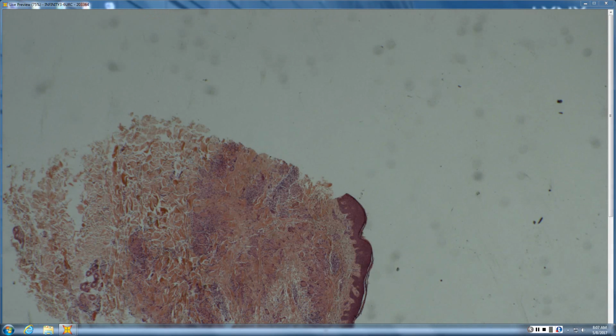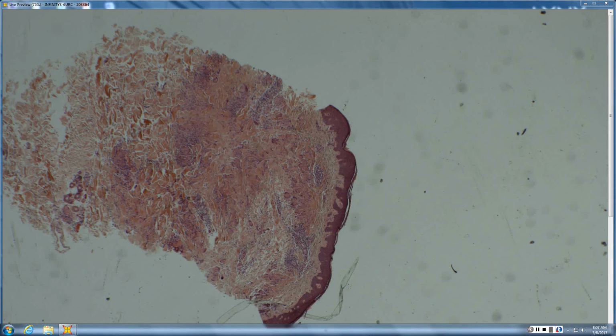So it looks like GA. Okay, so you get the easy button for that, and why GA? So you have kind of central necrobiosis with a palisade of histiocytes. Scan, you can see all the multinucleated histiocytes. Yep. So they're multinucleated cells as a clue that they're histiocytes. And so you have epithelioid cells and multinucleated histiocytes. They're in the dermis, sometimes in a palisaded fashion, and they are certainly patchy and focal, not top to bottom, side to side, which is what NLD would do.